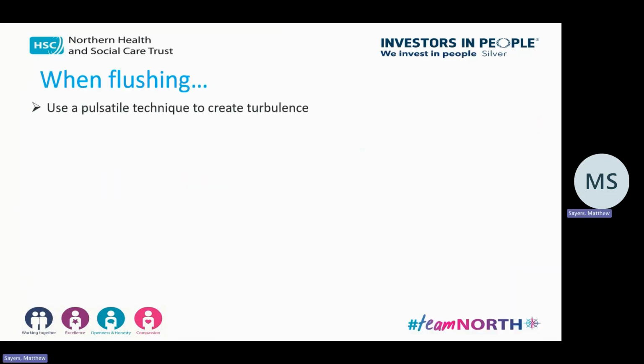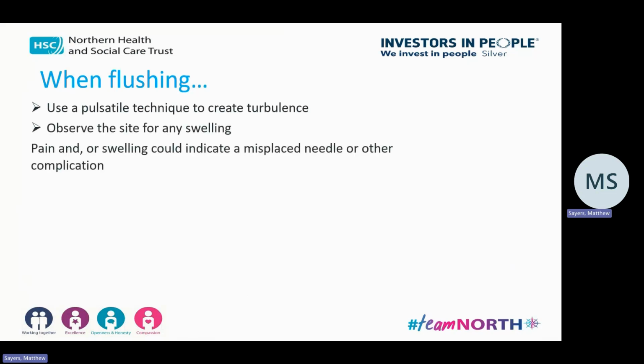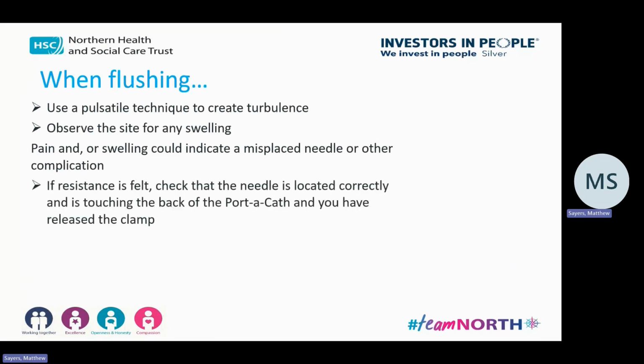Okay, so when flushing, remember your pulsatile technique to create turbulence. As you're pushing, Lisa was observing the site for any swelling, just in case the needle had moved position, because pain or swelling could indicate a misplaced needle.